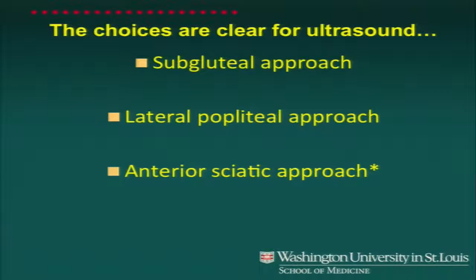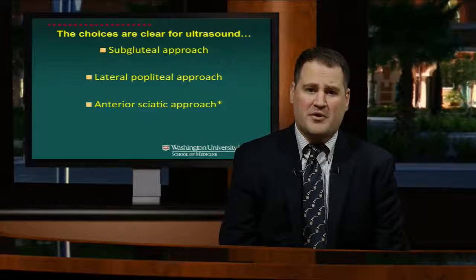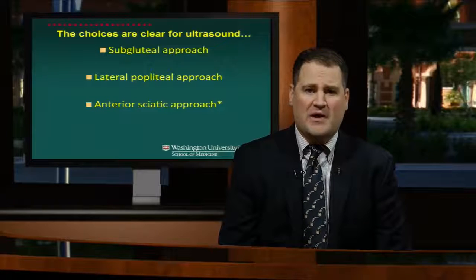For this presentation, we're going to focus on the 2 most ultrasound as well as catheter amenable approaches, the subgluteal approach and the lateral popliteal approach.